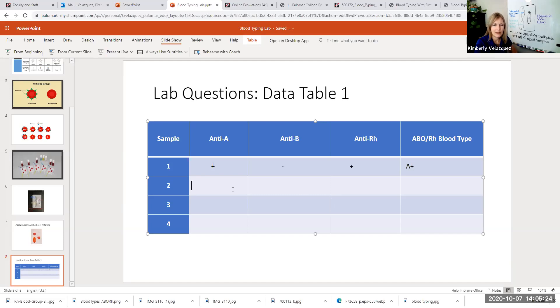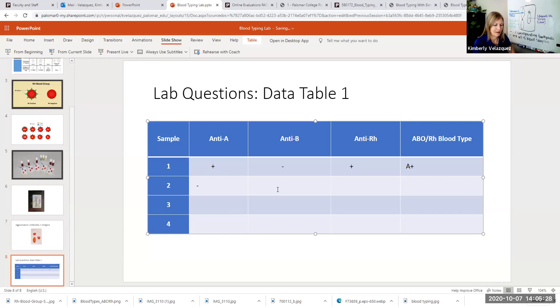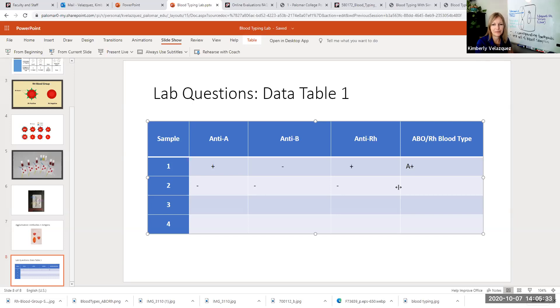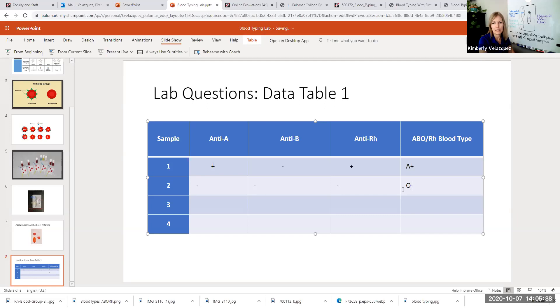Let's say we had negative, negative. That would make this O negative. So that's how you'll record your results.